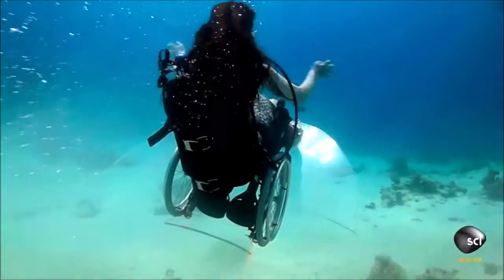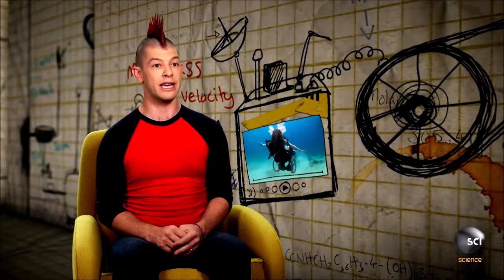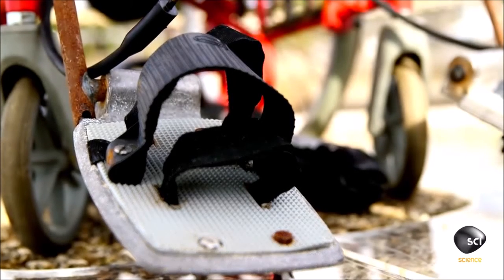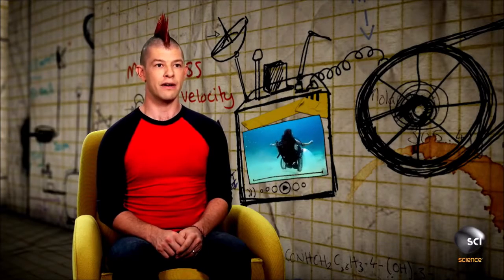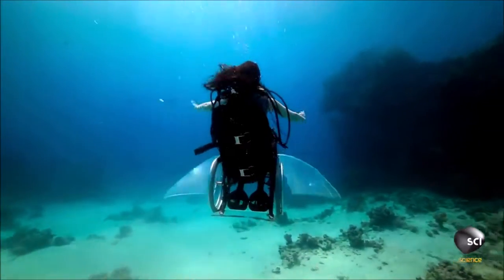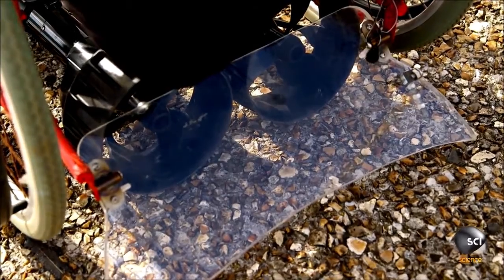Not only do these plates keep her stable in the water, but they also make it possible for her to navigate. With her feet she can press down on the left pedal and move the left plate, turning her left. Likewise with the right. There's another fin at the back of the chair and she's got five different positions to choose from. At the highest position she can actually do a backwards loop-de-loop.